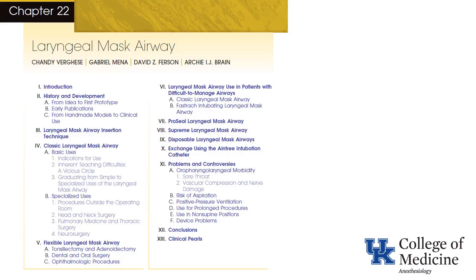I strongly recommend that you read this chapter from Hagberg and Benumof. The laryngeal mask airway has a very interesting history and has evolved to have many uses. There are some specialized laryngeal mask airways designed for intubation. Although this index mentions its use in non-supine positions, I must confess that I've never used a laryngeal mask airway in a non-supine position.